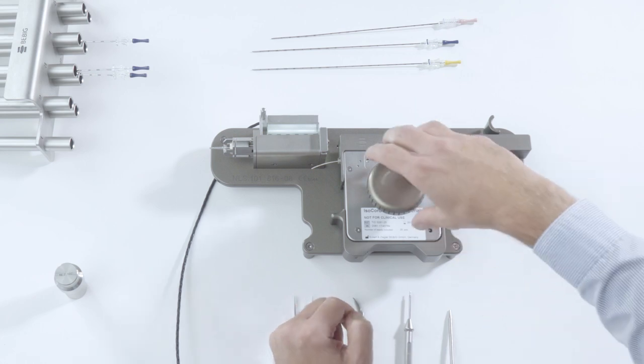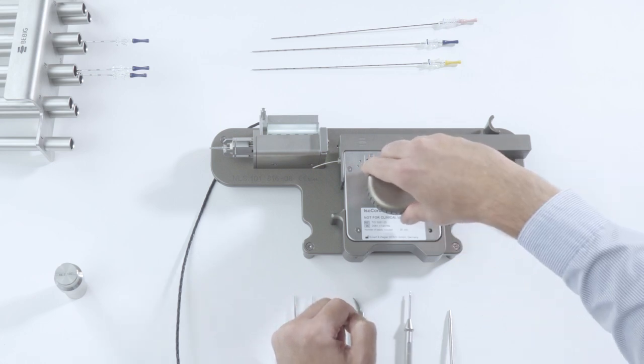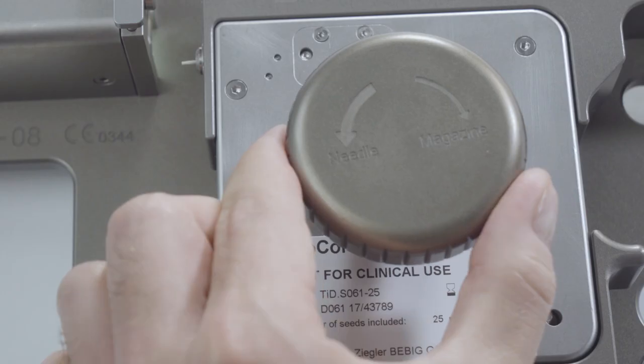Turn the knob clockwise in the direction marked magazine until the end of the seed chain is flush with the magazine holder.